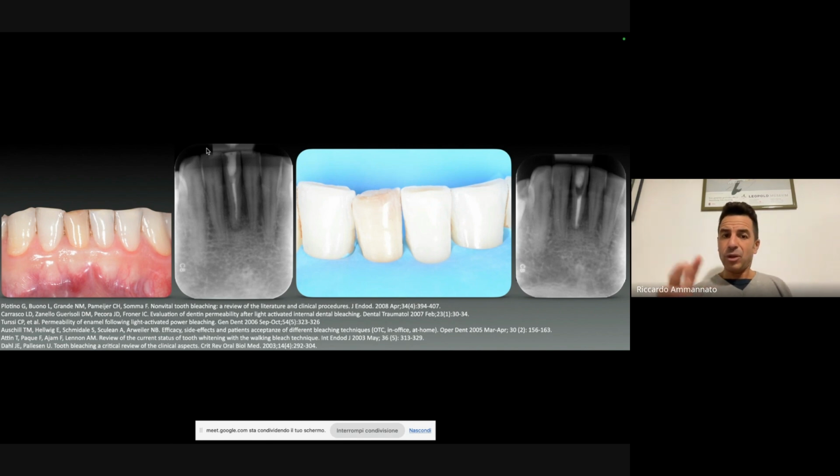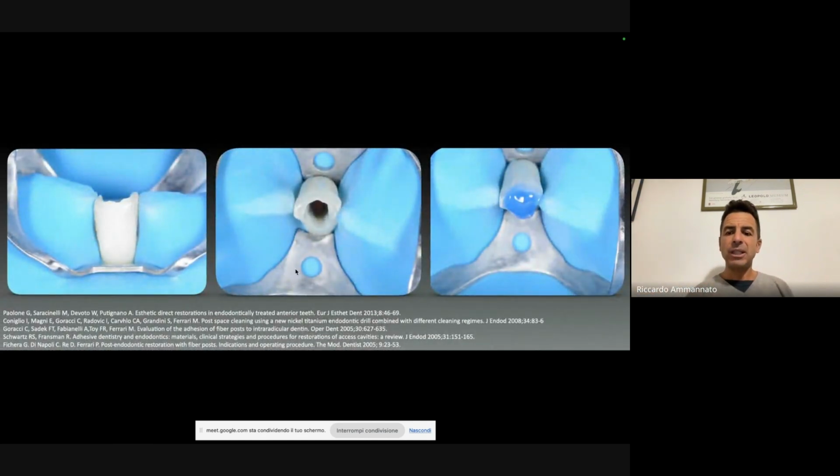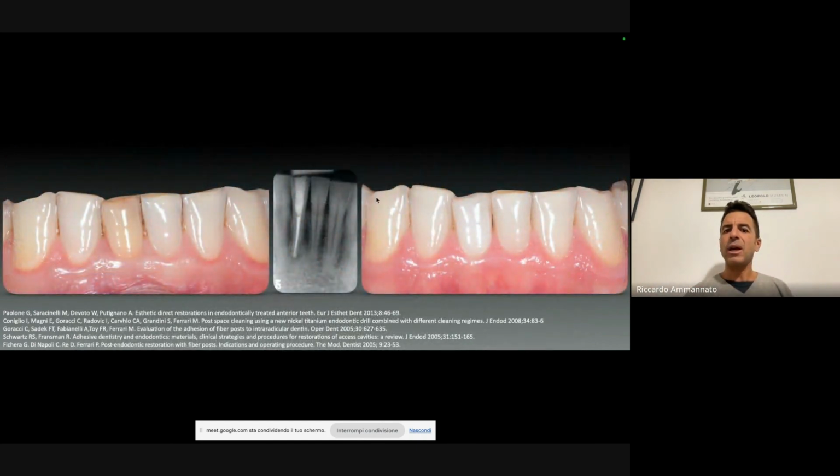Here, before doing all this, I had to do the root canal back again. This is the new root canal. Then I did a walk-in bleaching, home bleaching, and then I did a normal filling there. So this is before and after my bleaching and, let's say, the final filling of the root cavity.